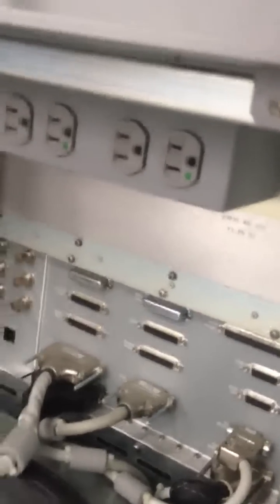Basically you can replace the whole Ethernet cable by opening the bay and removing the Ethernet cable from here, and then from here, and yeah, I think that's it.